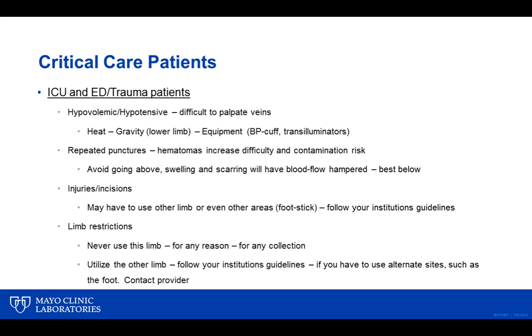Injuries, incisions, we have to worry about that. Some people forget, they'll move an arm a little bit, they might have chest surgery or something like that and cause that patient a great deal of pain, or shoulder surgery. We always got to be looking at those sorts of things. Sometimes we can't use the arms due to lines or injuries or surgeries or whatever. We have to get a foot stick order. You have to follow your institution guidelines there. It's just different things you need to look at and look at the whole thing.